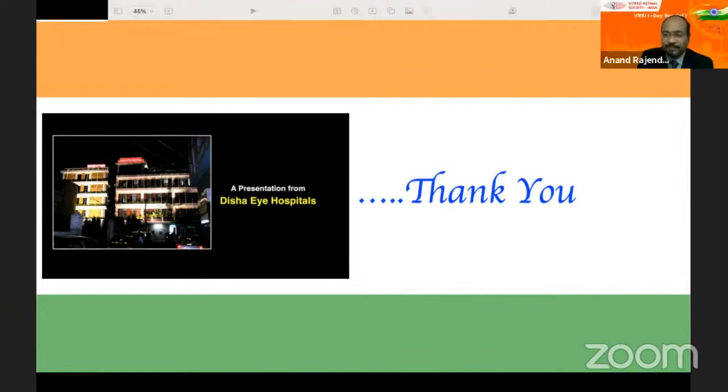If the CNVM is large, then a large size. In most situations, large CNVMs are present, so that means a large size graft is necessary. And the size of the graft, you can see it is 3 by 2 or 3 by 4. That size you can judge from the size of the disc, 1.5 millimeter, 2 times or 2.5 times. Yeah, my only comment, terrific surgery.